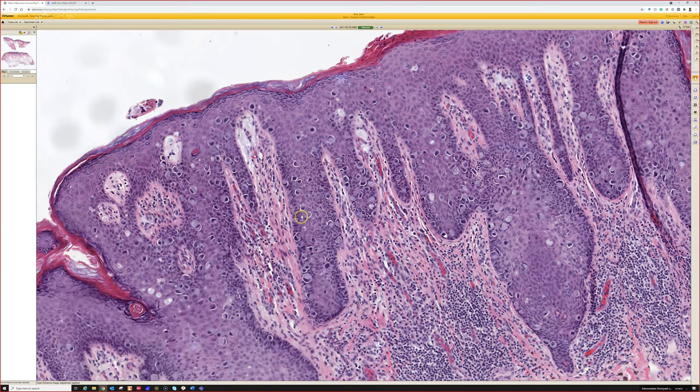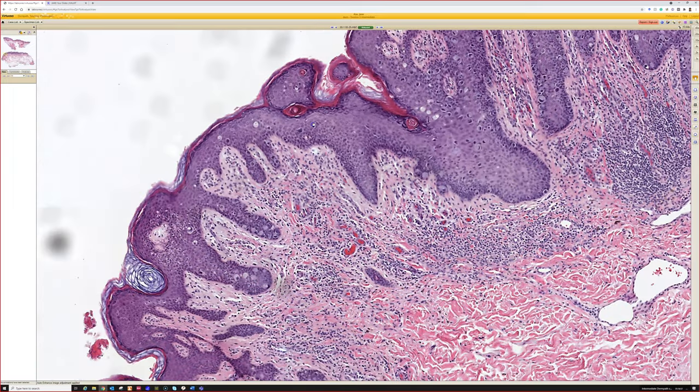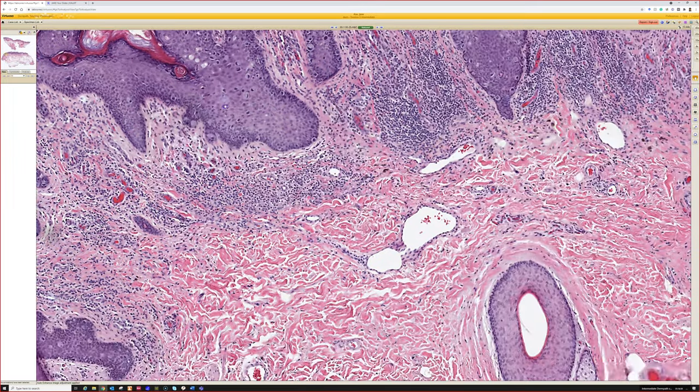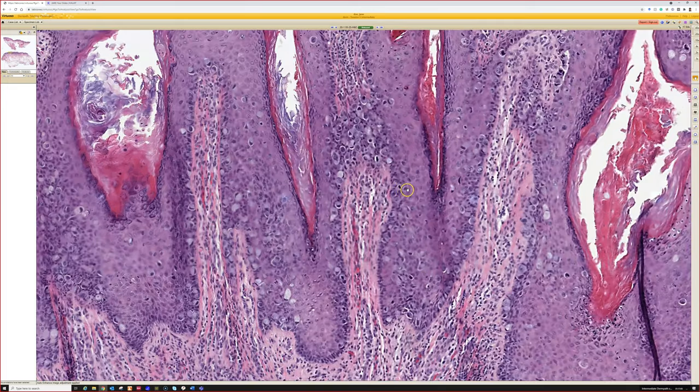And of course, remember that melanoma can have Pagetoid spread and so can squamous cell carcinoma in situ, as well as a few other things like sebaceous carcinomas. In this setting, in the genitals or in the nipple, and you see this, it's Paget's until proven otherwise, okay? And then you can do the stains to prove it.